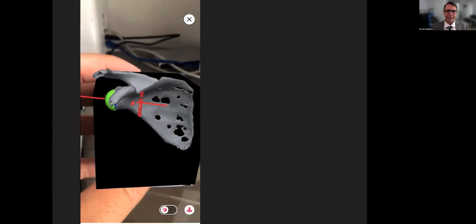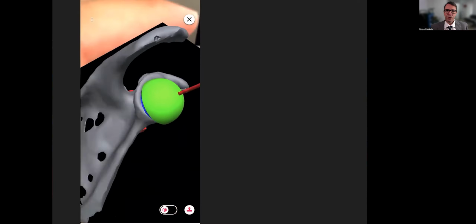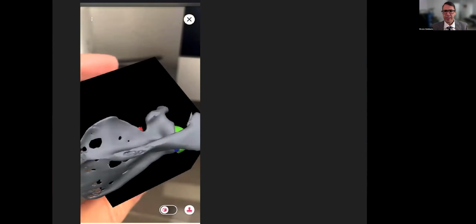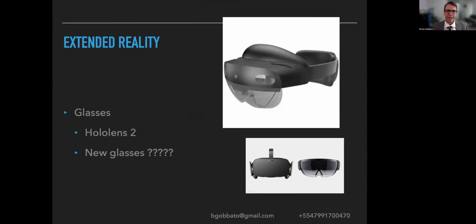This is an example of another company's planning that we use to check prior to the surgery what we plan to do using this kind of cube called Merge Cube. Just export your planning to the software and you can check it using this kind of cube.